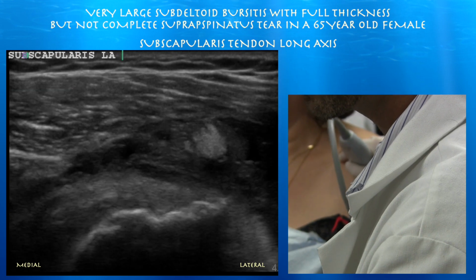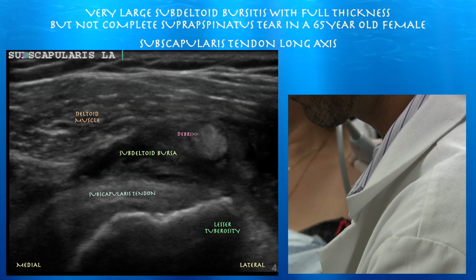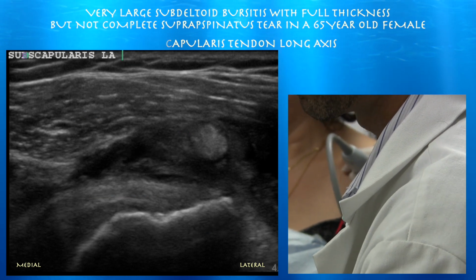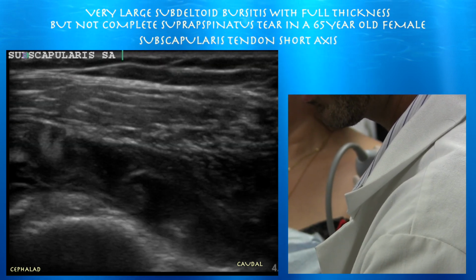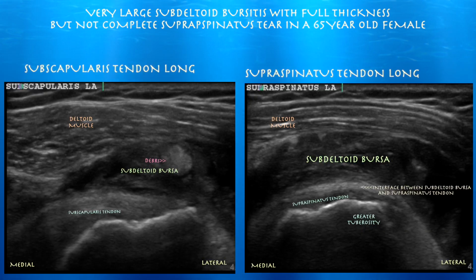Subscap tendon in long axis, left side of the screen is medial. Subscap tendon looks preserved. And there you can see the subscap tendon inserting on the lesser tuberosity. Okay, now we're going to look at it in short axis, and again you can see the tendon pretty nicely. And here you can compare the thickness of the subscap tendon to the thickness of the supraspinatus tendon, and you can appreciate that it's much thicker than the supraspinatus tendon.